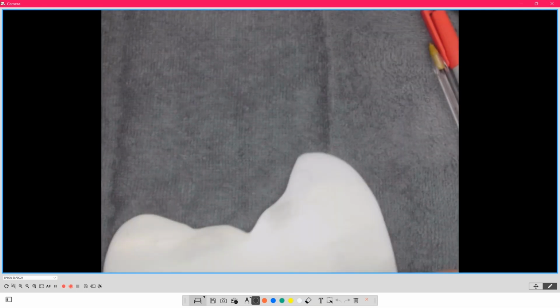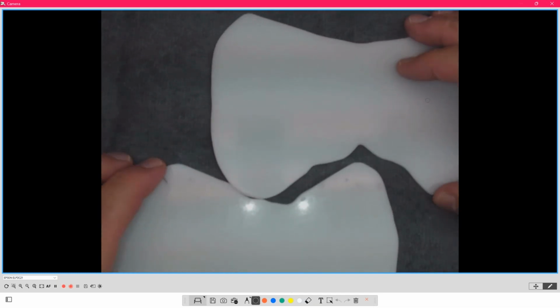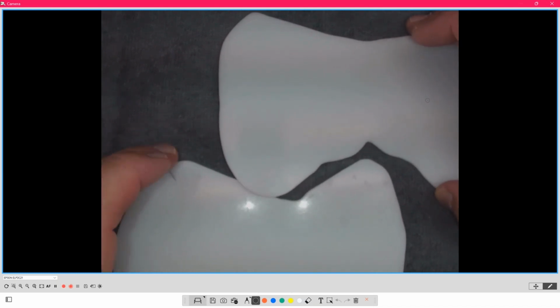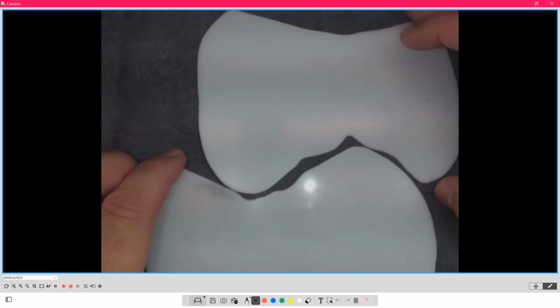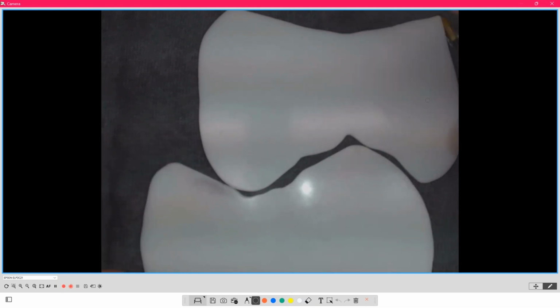And essentially the freedom in centric concept is unique to only a few teeth on the market. The teeth actually have the ability in centric to slide left and right within centric. Okay, let me flip that this way. That's how it should be. Within centric, it can slide about a millimeter and a half. That's freedom in centric. All 0, 10, 20, 30, 33 degree teeth from any manufacturer do not incorporate that.